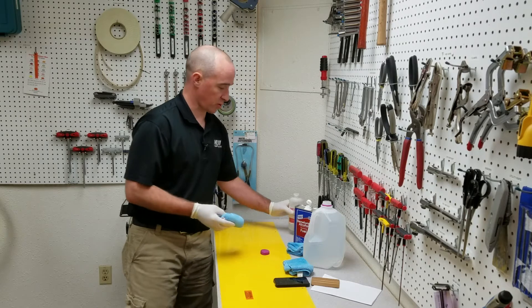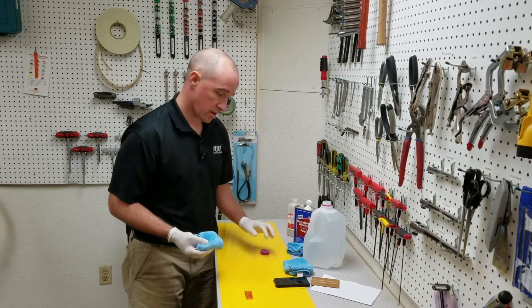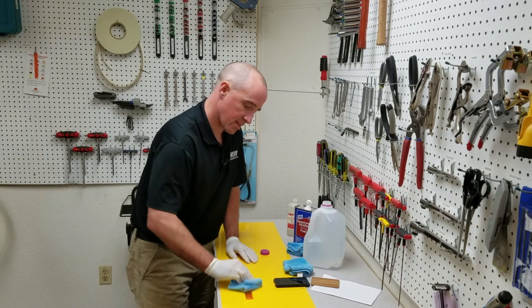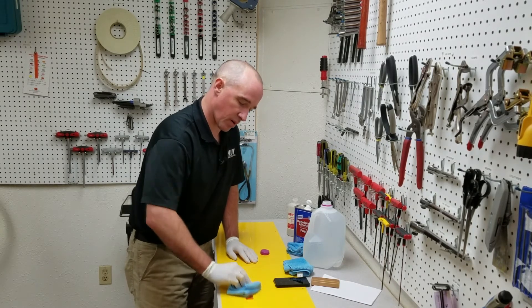Our last solvent, isopropyl alcohol. 15 more seconds.